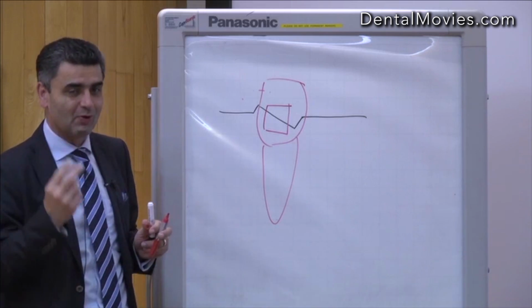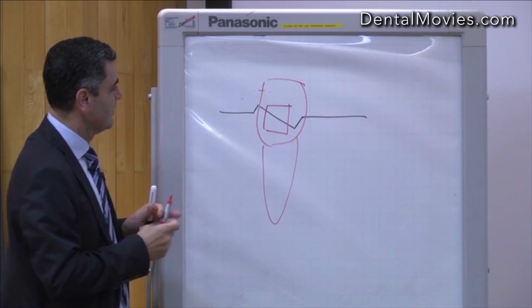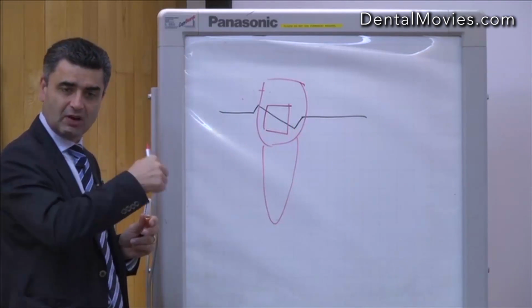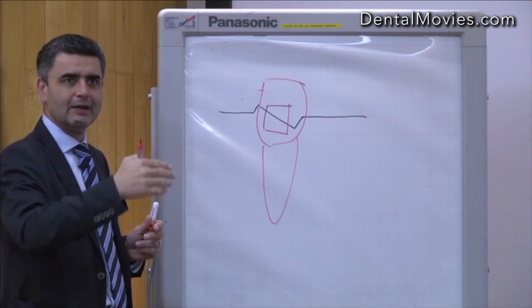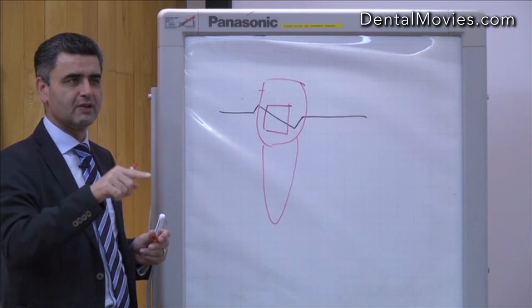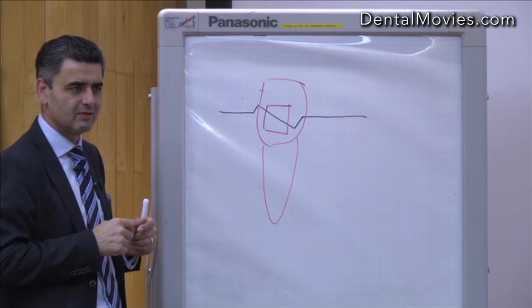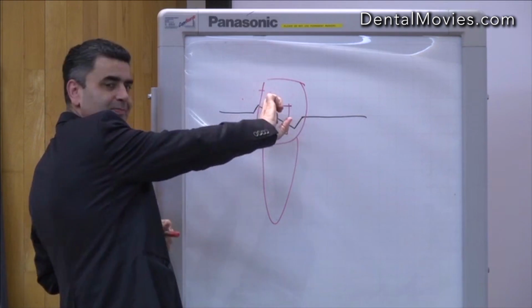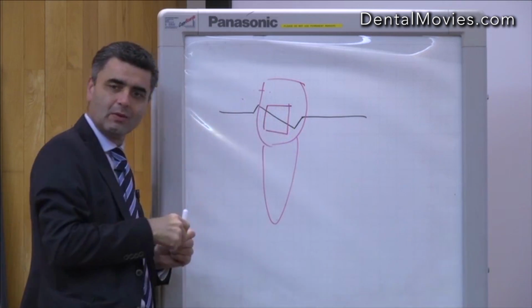Right? Second order bend is a tip, right? The low side of the bend is the side the tooth's going to tip to, right? So remember LT, or low tip, low side tip. It's pretty easy, isn't it? Okay. So if you got this plier and you did this bend and the low side's here, then you're going to tip it the other way.